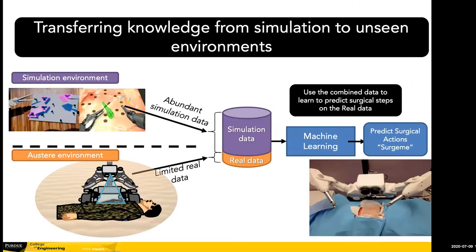Now that we also have simulation, you can very easily augment the amount of data. So how much real data do we need, and how much can be simulated, to be able to transfer the skill effectively? I want to have this combination of real data, which we know is very limited because we don't have data almost from austere scenarios, and simulated data, of which we can generate a lot. We're going to combine that and train a machine learning algorithm, and see to what extent we can get rid of the real data, or use the necessary minimum, and maximize the simulation to keep good performance.